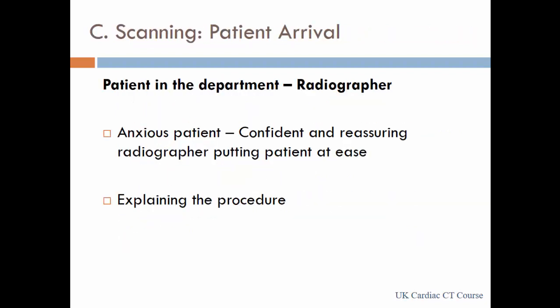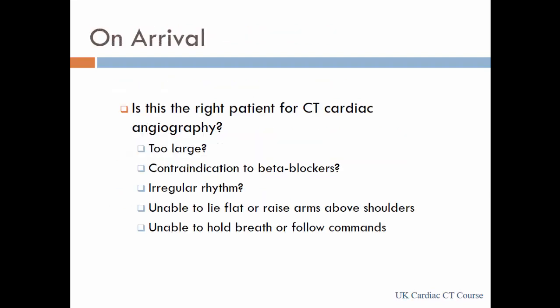When the patient comes to the department, the important thing is they have to be reassured and relaxed, because they're quite anxious. They're coming for a coronary scan. They have been told they might have coronary blockages, etc. So the staff who meets them, it's very important that they ease their anxiety at the time. Explaining the procedure properly is a very important aspect.